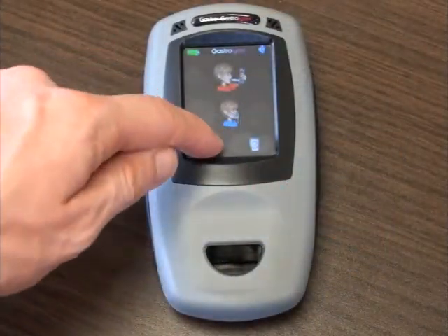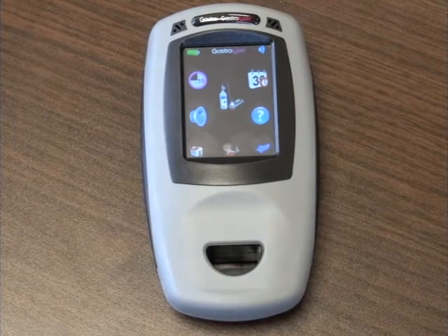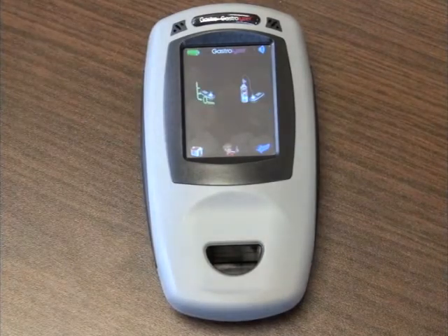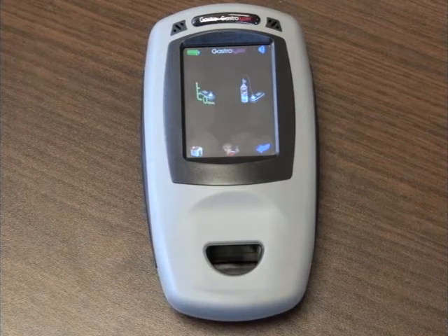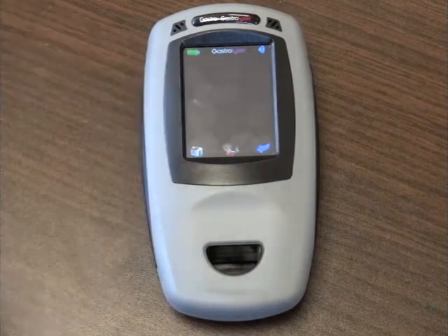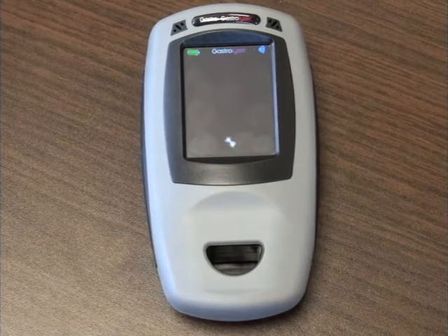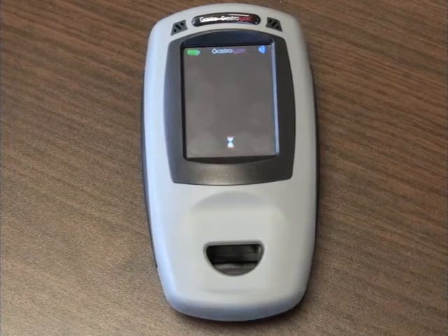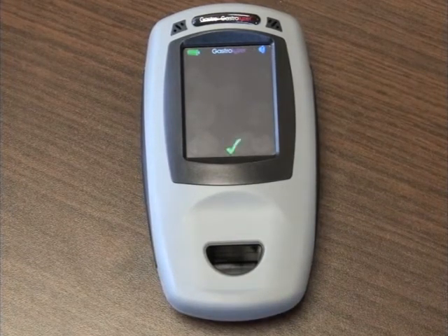Before calibration, you must zero the monitor in ambient air. To do this, select the zeroing icon by clicking the options menu icon and then selecting the zero calibration icon in the centre. You will now see two options: the icon on the left will zero the monitor, and the icon on the right will start the calibration process. Please select the zeroing icon to begin. The instrument will take a few moments to zero itself and will display a tick when zeroing has been completed.